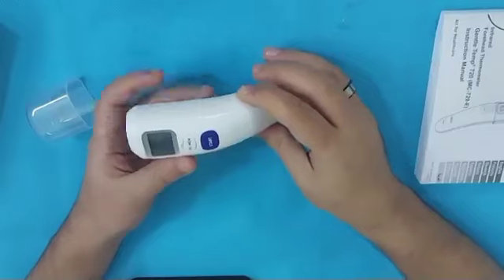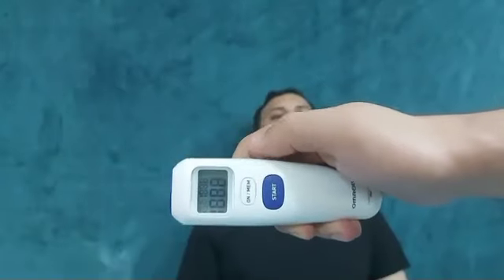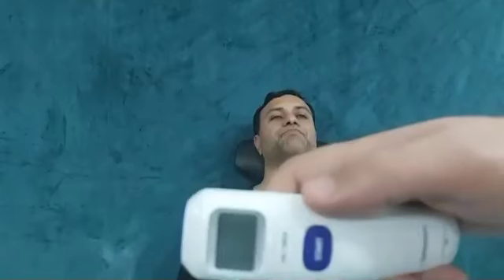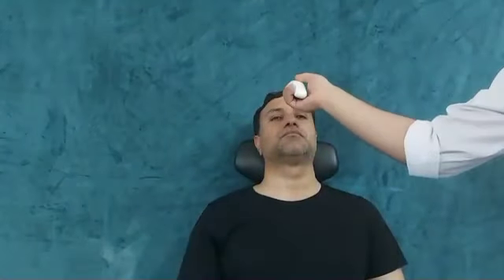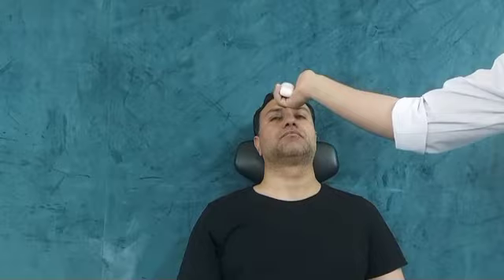As you can see, the display begins to work. To measure the temperature of the forehead, push the On button and three lines will show on the thermometer's display. After that, keep the scanner 1 to 2 centimeters away from the forehead and press the Start button.